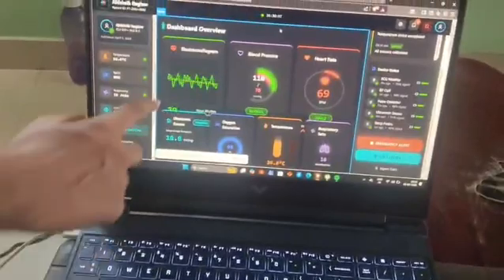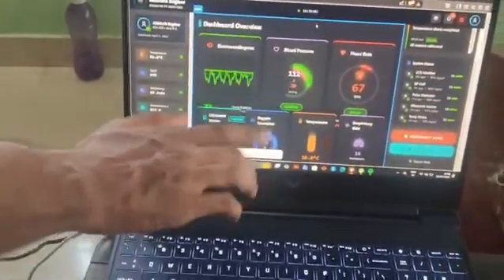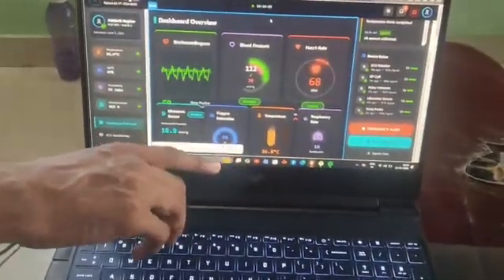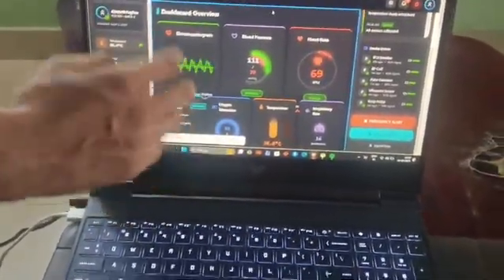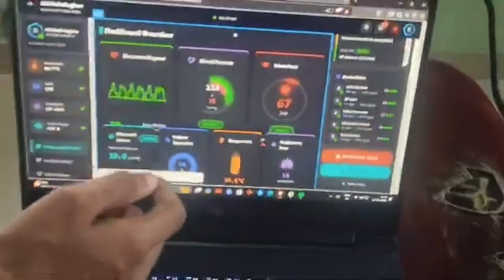A graphical representation of the patient data is shown. The indicator shows whether the patient is normal or critical. When the patient is very critical, an alert notification for the abnormal condition is triggered, and the system automatically takes action, such as an emergency alert or calling the nurse.